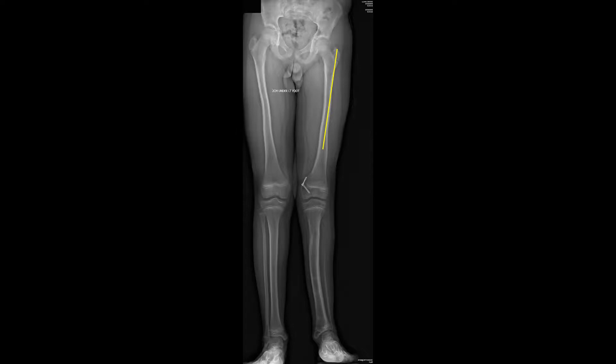In most cases, it is desirable to use a significantly shorter nail than what would typically be used for a trauma case. Again, this is because we are placing a straight nail into a curved femur, and we want to avoid friction. This patient with congenital femoral deficiency as well as fibular hemimelia is skeletally immature and has the majority of his discrepancy in the femoral segment. Thus, we chose a trochanteric entry femoral nail.